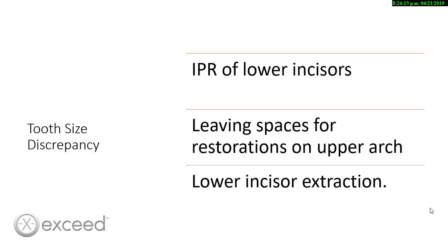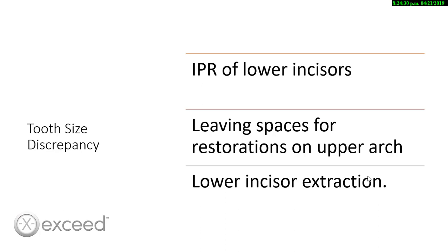We should also always check if we have anterior contacts. Those anterior contacts normally are going to create a posterior open bite at the end of the treatment. Normally we can solve it by doing lower IPR, we can leave spaces for restorations on the upper arch and that will increase the overjet, or we can do a lower incisor extraction, and normally that space is closed really well with the aligners.